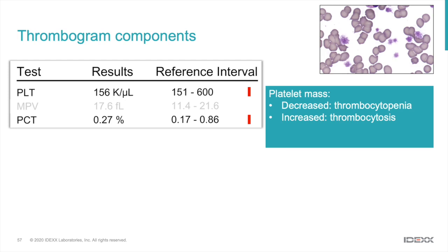And in many situations, that platelet crit is actually a better measure of the platelet mass than the platelet count itself. We're interested in talking about, well, how much phospholipid content in the membrane and cellular components are available for the coagulation process. And the mass of platelets is, in many, many cases, more important than the platelet count.